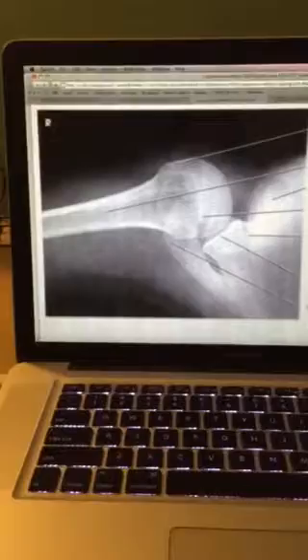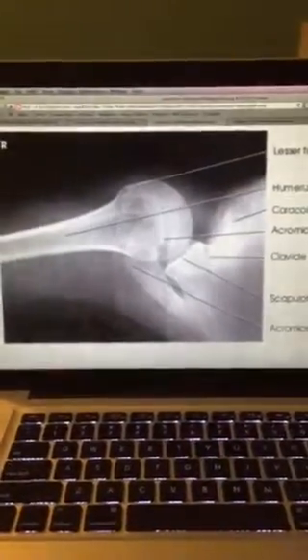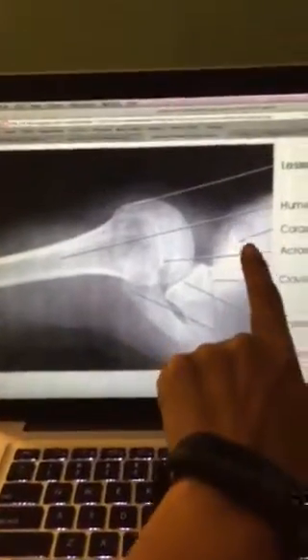Next we're going to be looking for the scapulohumeral joint, which is right here. And then the coracoid process projected above the clavicle, which is right here above the clavicle.